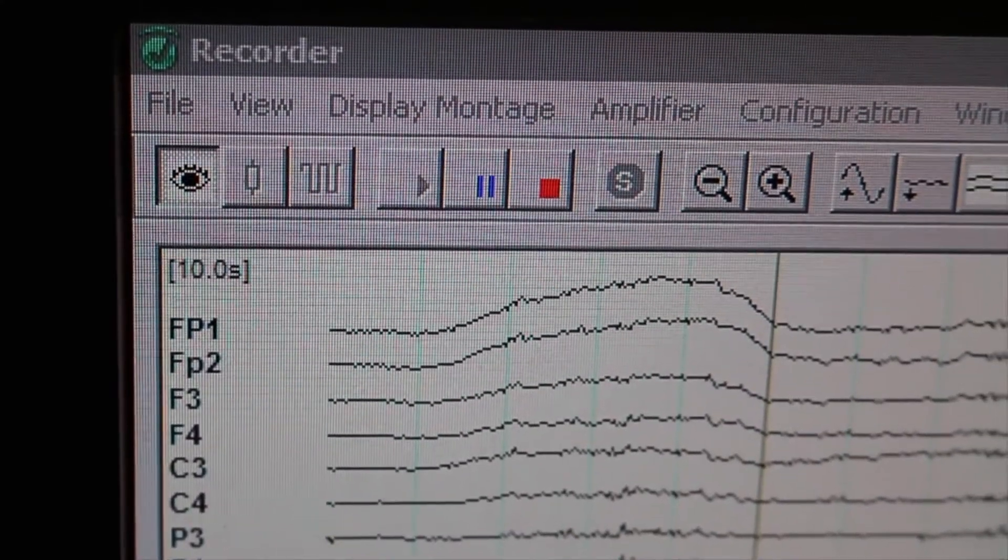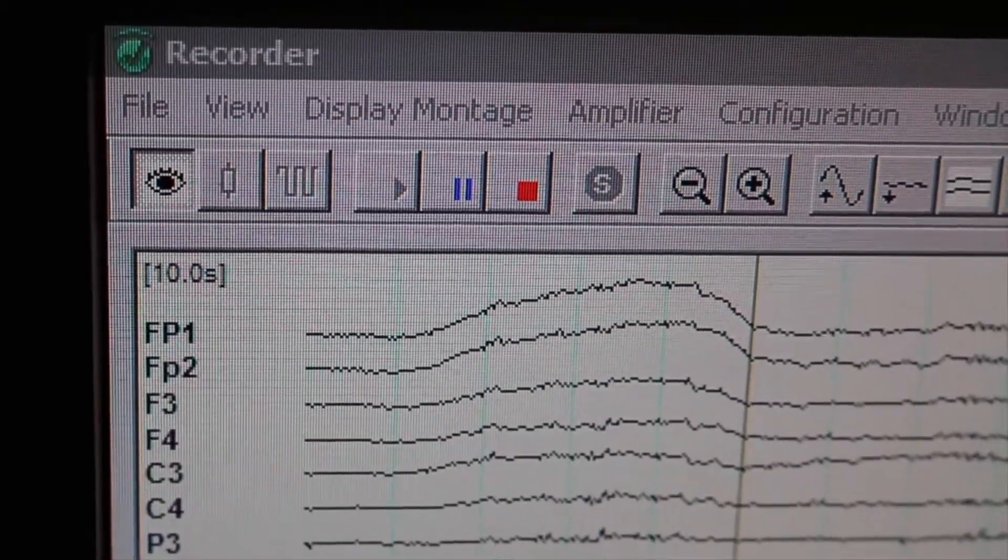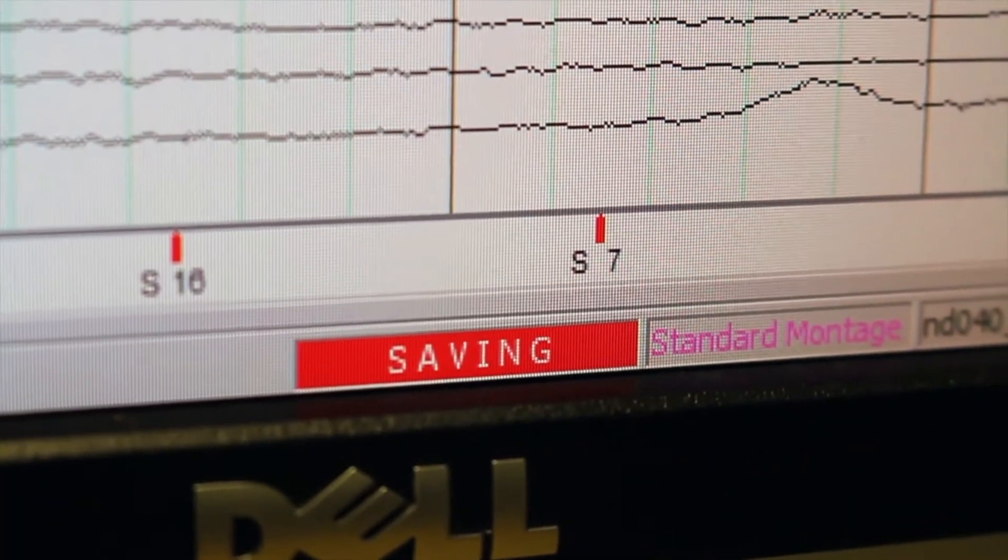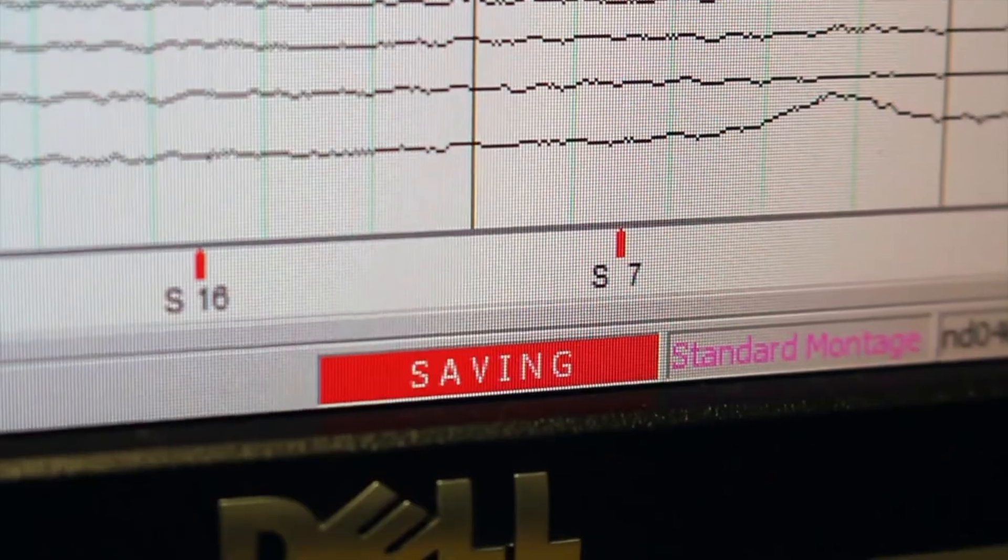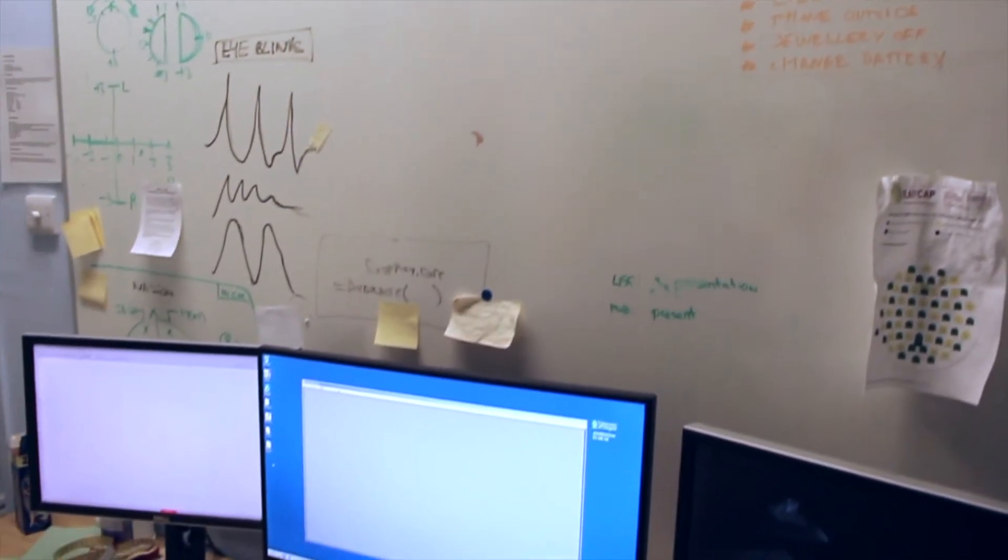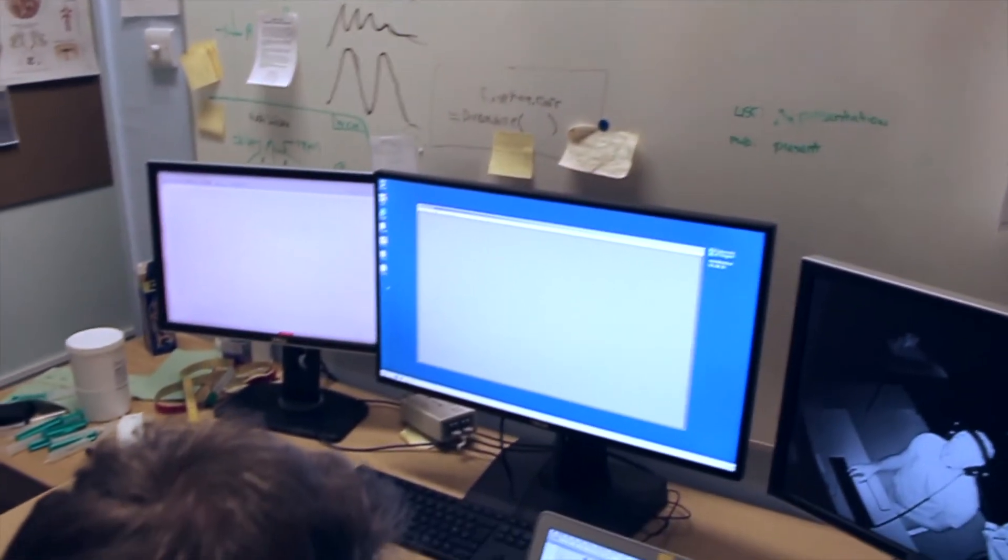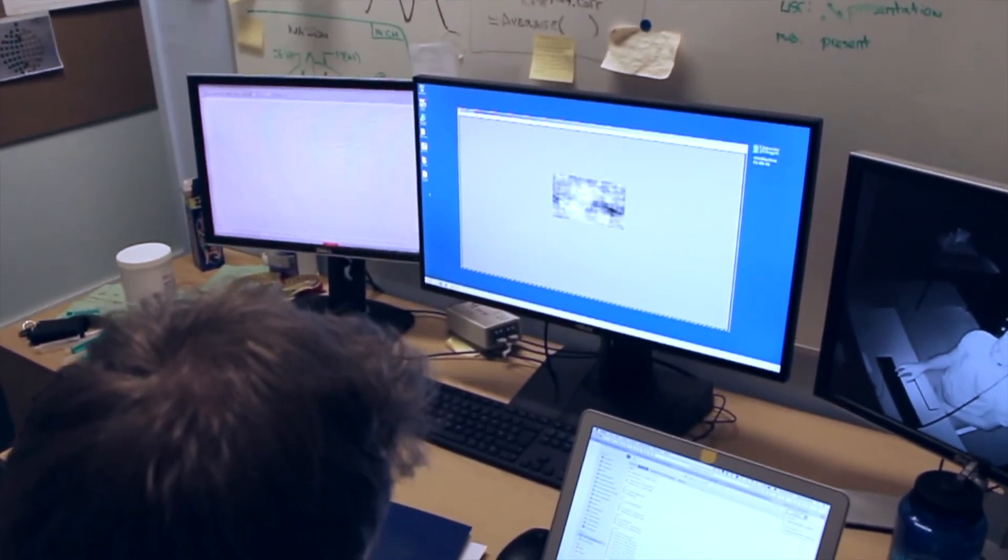Once you are ready, begin recording the EEG data in the monitor and ask the participant to start your task. You may be able to use a screen viewer program, such as VNC, to mirror your participant's screen and keep an eye on where they are in the experiment.